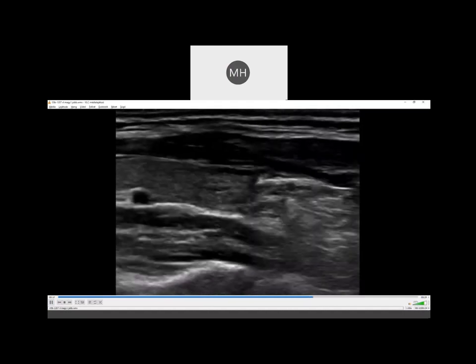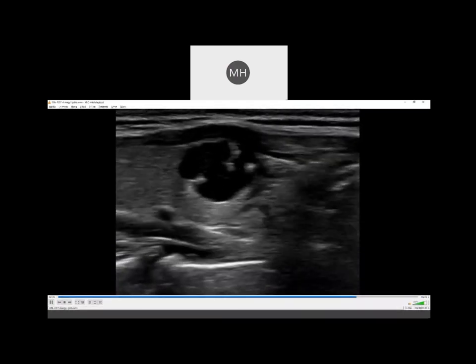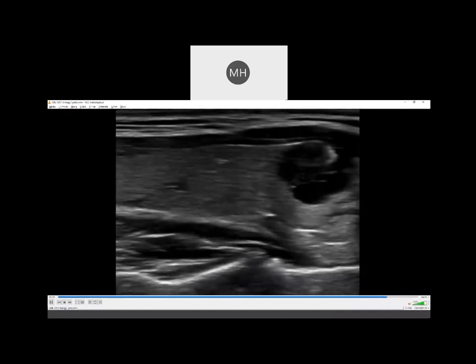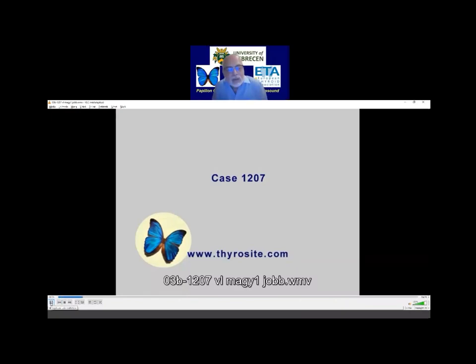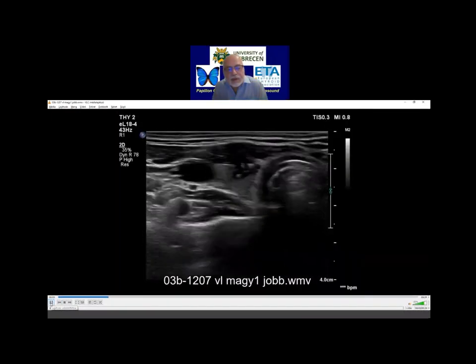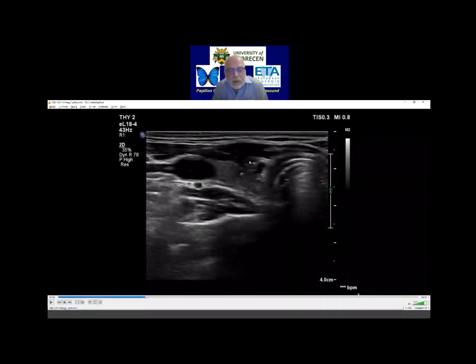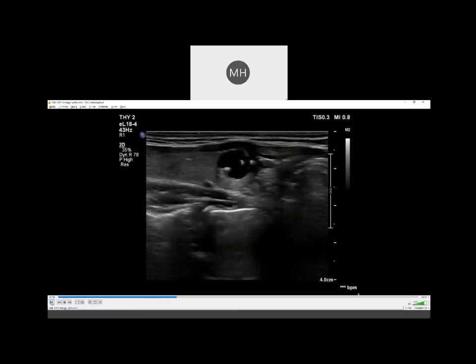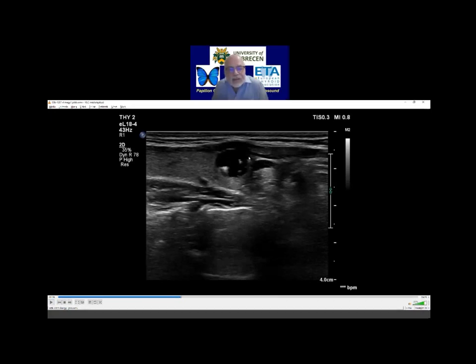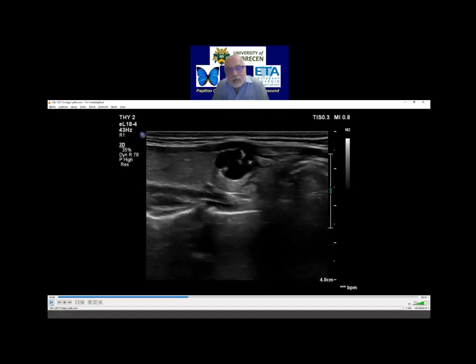Question: is the anterior limit of the nodule infiltrating the capsule of the thyroid? No, I don't think so. It was a benign nodule. But you are right — we do not see the capsule here, and that is caused by the fact that the cystic part and the sternocleidomastoid muscle have identical echogenicities. So in this case, that was a very clever comment.